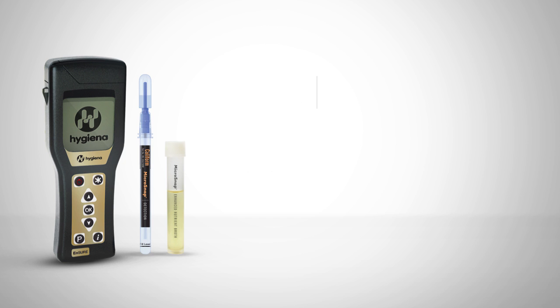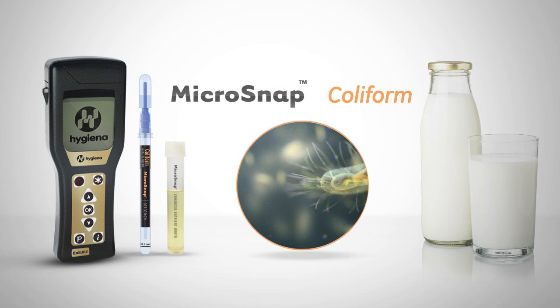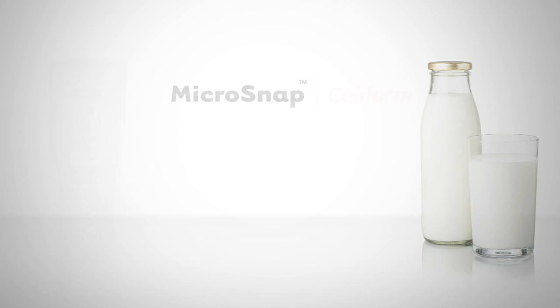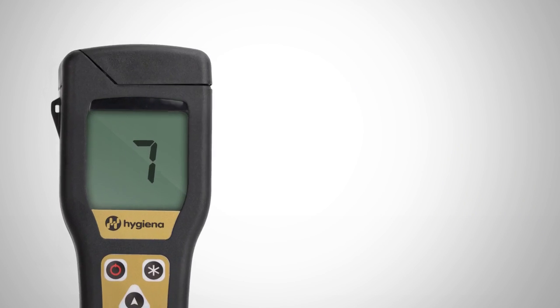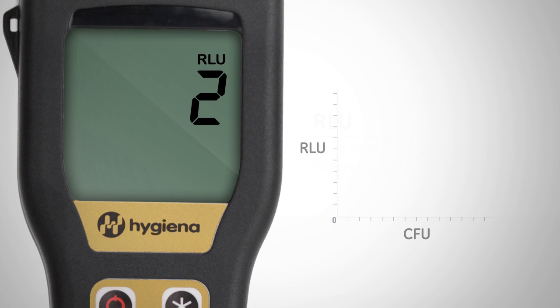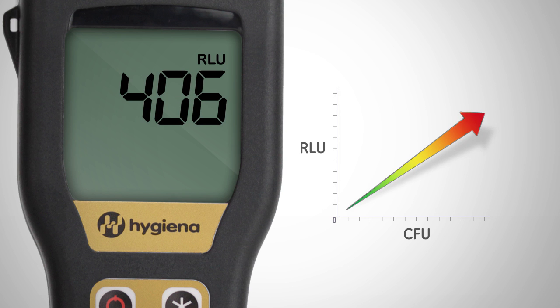Microsnap Coliform is a rapid test for the detection and enumeration of coliform bacteria in milk products. Together, Microsnap Coliform and the Ensure Luminometer measure the coliform bacteria present in a sample. Test results are delivered in 15 seconds and are measured in relative light units, or RLUs. The greater the amount of bacteria, the higher the RLU number and the higher the CFU count.